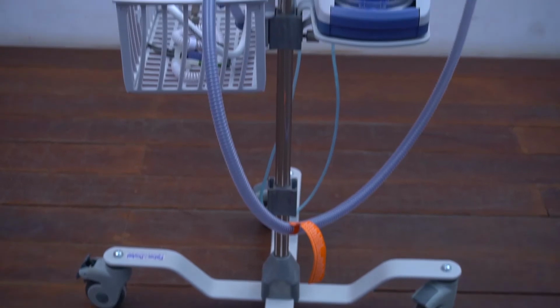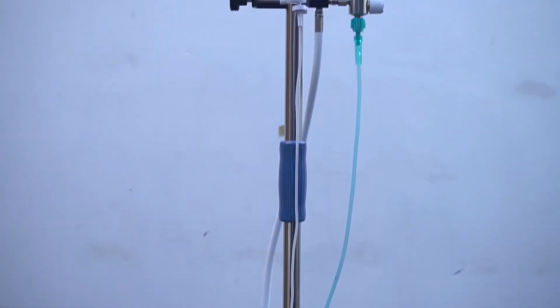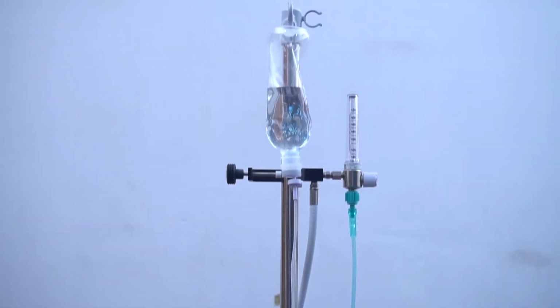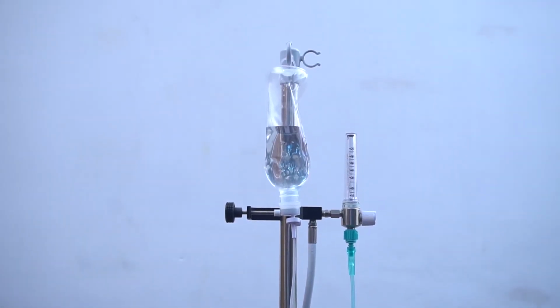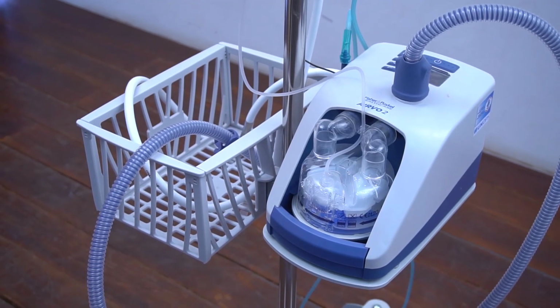This high flow ventilation is very uncomfortable to the patient due to its high flow. Therefore, we need to use this high flow device only when it is absolutely necessary. In addition, this device uses a lot of oxygen. If you are having an oxygen shortage, this is not a good device to use.